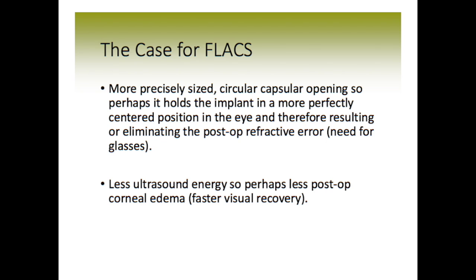Very rarely there can be permanent edema in the cornea, and the claim would be perhaps there would be less of an incidence of that as well using the laser to soften the contents first.